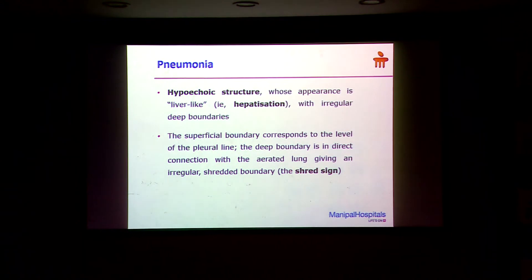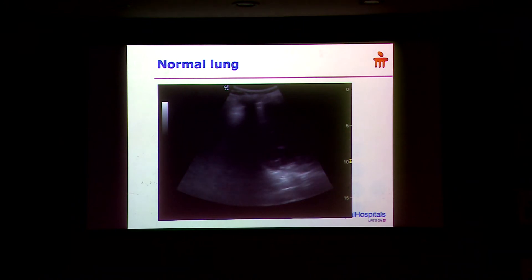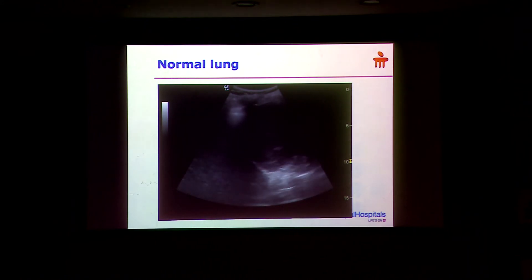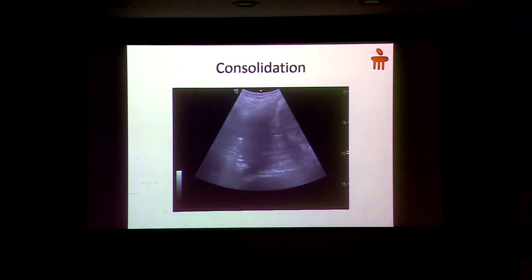Next is pneumonia. How will it look? Here I am showing you a normal lung — the lung is here, the liver is here, and it is moving. You cannot see almost anything; it is called the curtain sign because it looks like a curtain coming and going, because there is no lung pathology. As soon as you have a lung pathology, now you see a tissue-like or paper-shred appearance, and it is white.